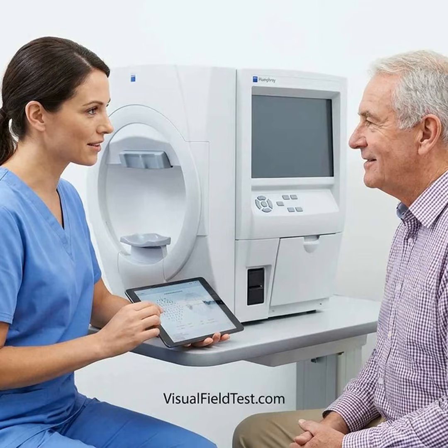Direct research on a separate interactive perimetry simulator is still limited. However, studies comparing video and spoken instruction consistently suggest that visual explanation improves understanding and confidence. In one prospective study of 120 patients with no previous experience of the test, patients receiving video instruction had better reported relaxation and motivation than those receiving verbal instruction alone.